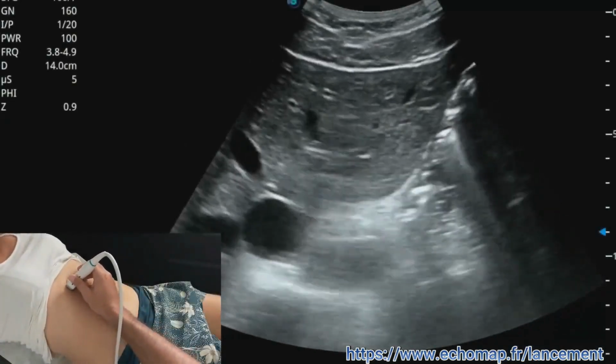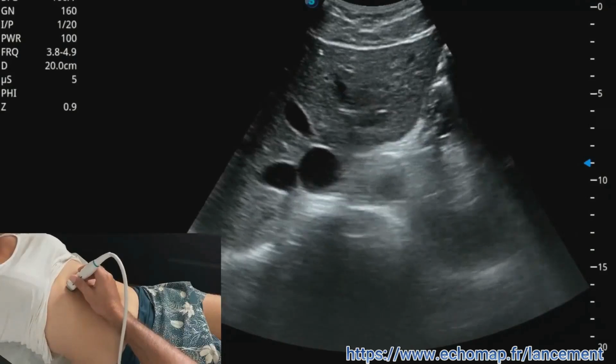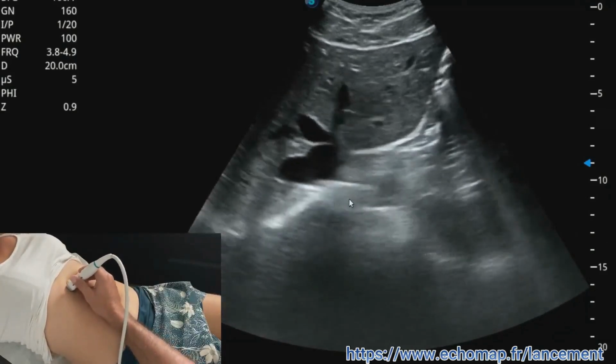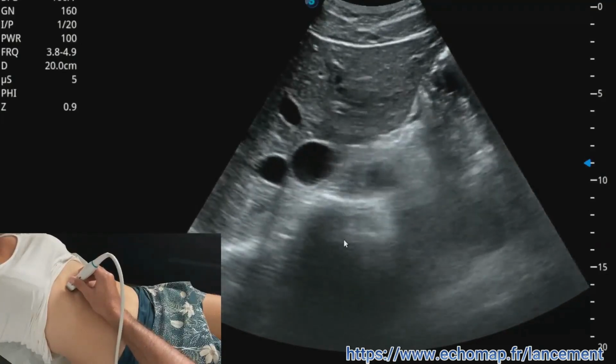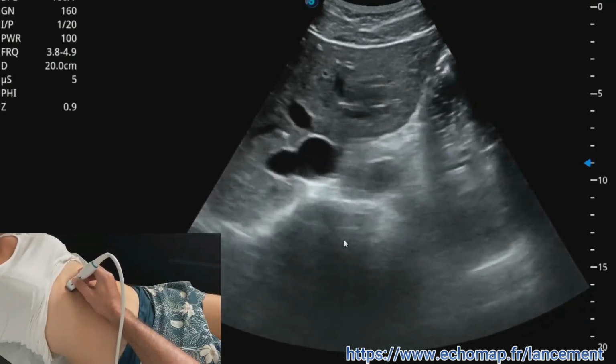And I encourage you from the outset to put a lot of depth into it. Why put in a lot of depth? Because I'm going to ask you to start by spotting a big cone of shadow here, which is actually the vertebra, and this will be a good place to start. The aorta is in front of that big cone of shadow, a little to the left, and it's beating. So you see that already we spot the aorta.